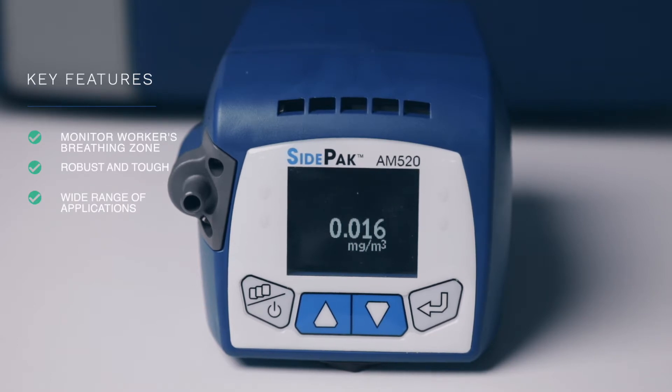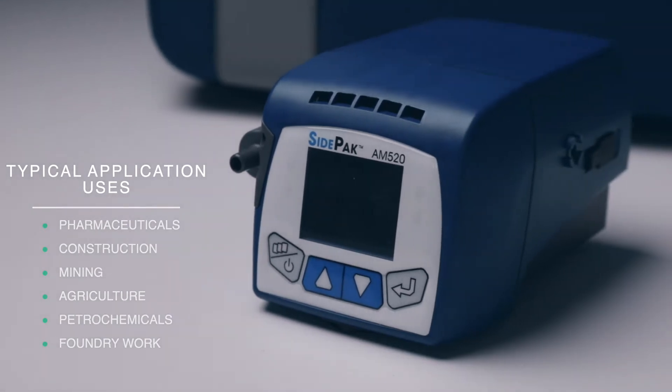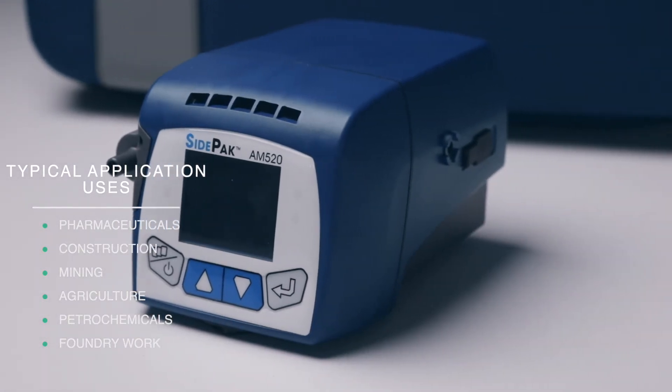The SidePak AM520 is suitable for various applications and is robust enough to survive rougher use in industry. Applications can include pharmaceuticals, construction, mining, agriculture, petrochemicals and foundry work, to name a few.